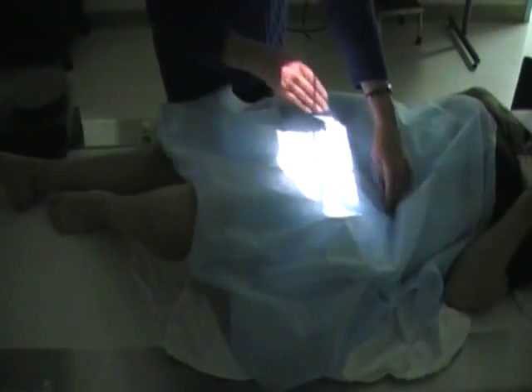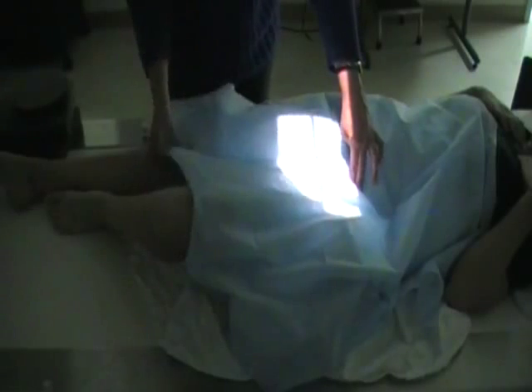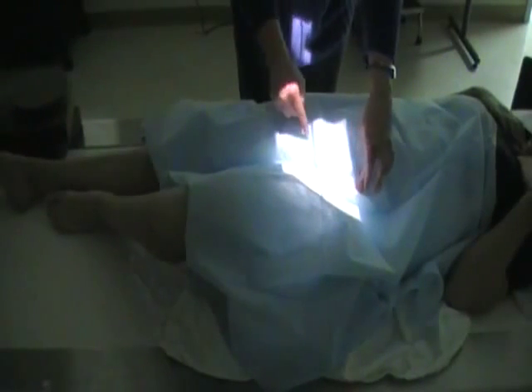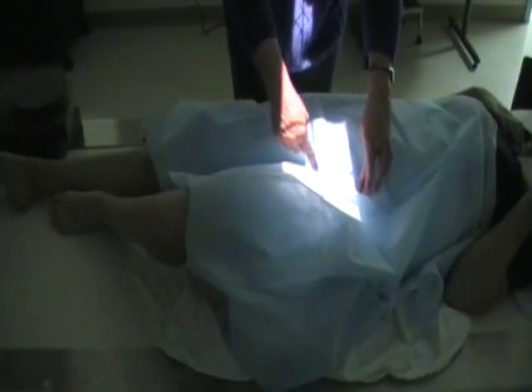Okay, so we should still be at the same positioning point. ASIS, greater trochanter for the pubic symphysis. Draw your imaginary line and go down 2.5 inches to be right at the neck of the femur.